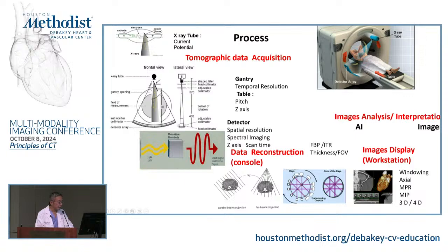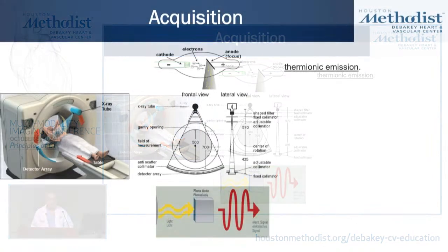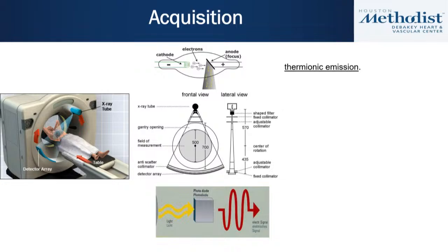Okay, obviously we had a conference yesterday just talking about this, and because of the audience here, we don't need to go into too many details. So I'm going to focus on things that would be important for you to understand when we mention some of the terminology of CT.